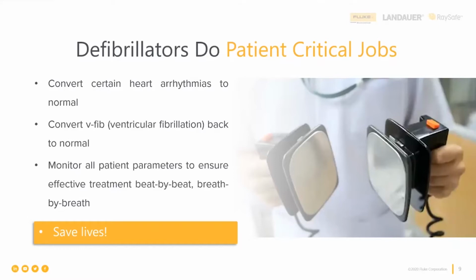Yeah, I sure did. When I started working on defibrillators 20-some years ago, it was literally just that. I am also a firefighter, and we would normally just carry a defibrillator in one hand. If you wanted a patient monitor, it was a separate box. Then as defibrillators evolved, we married those two devices into one box, and we had monitor defibrillators. Then as time went on, we added a pacer to it. So now we have monitor, defibrillator, pacers. You're actually testing three devices when you're looking at that defibrillator on the shelf.